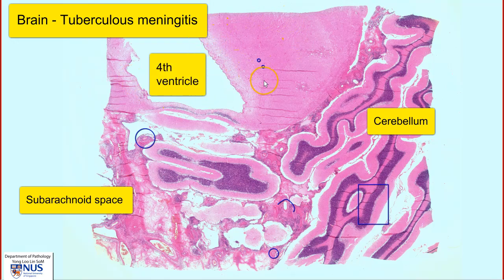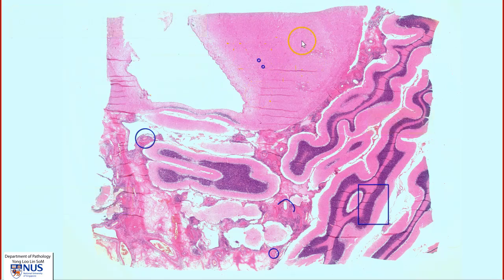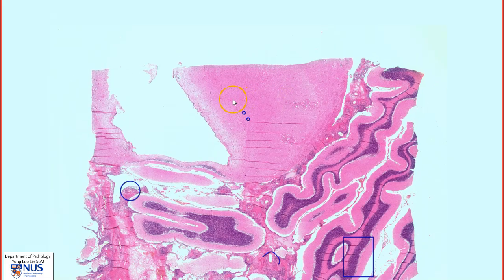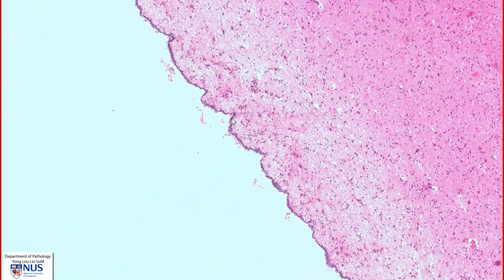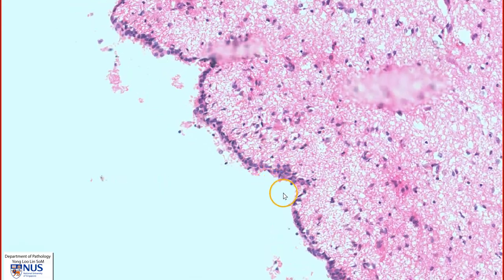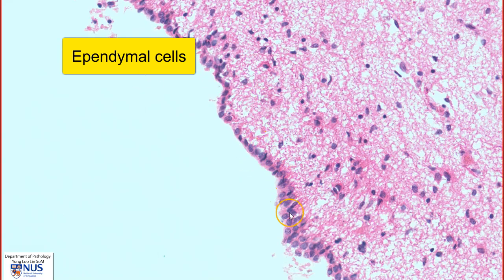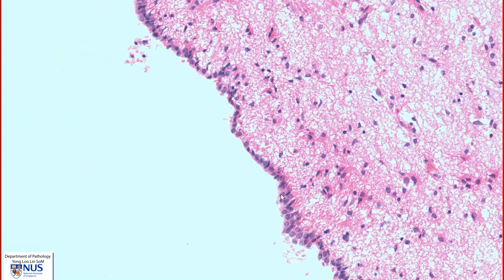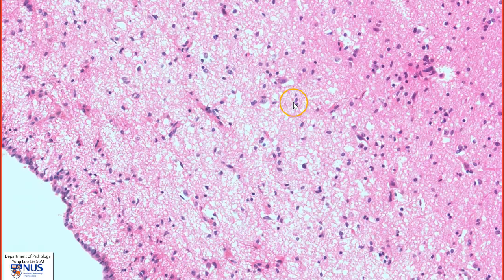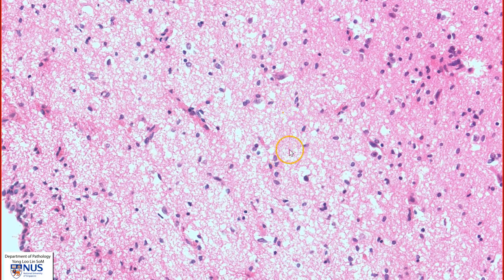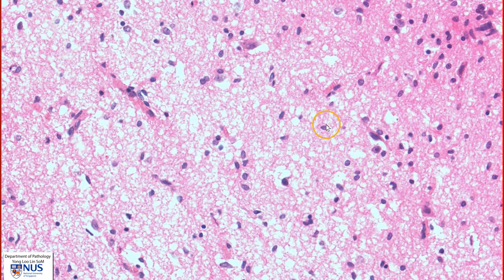Over here we have some white matter and gray matter just around the fourth ventricle. Let's do a very quick recap of normal histology first, starting with the fourth ventricle. We can see that the ventricle is lined by a single layer of cuboidal to low columnar epithelium — these are ependymal cells. Adjacent to this, we can see the white matter, which is predominantly composed of glial cells including astrocytes, as we can see here with the small round to oval nuclei.